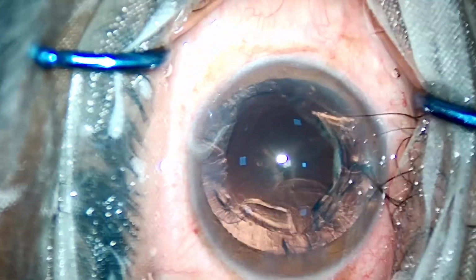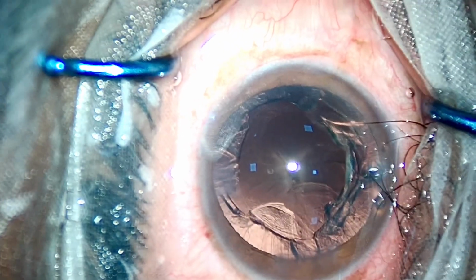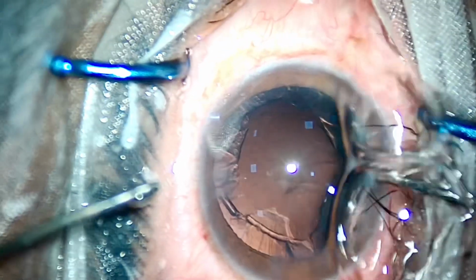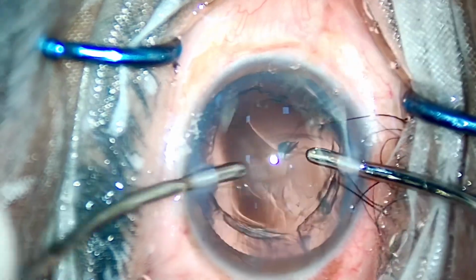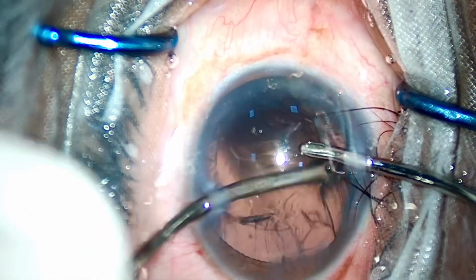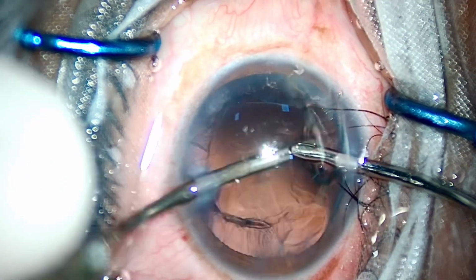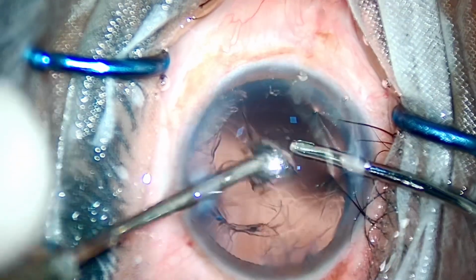but any degree further you go, you have a chance of inducing surgically induced astigmatism in the patient. These patients can never achieve 6 by 6, I must tell you. So it's better for beginner surgeons to know this fact, to place the side ports directly perpendicular to the main port.